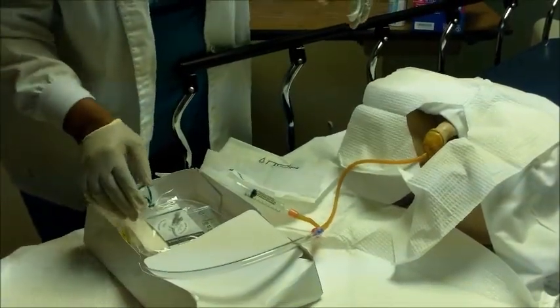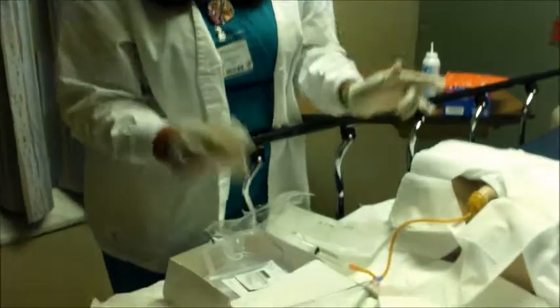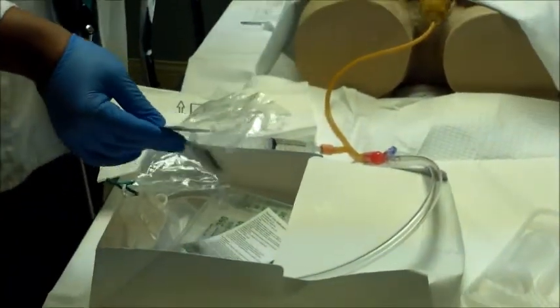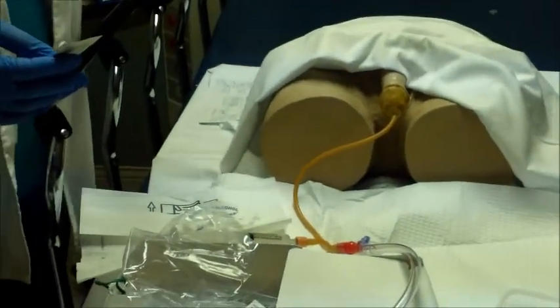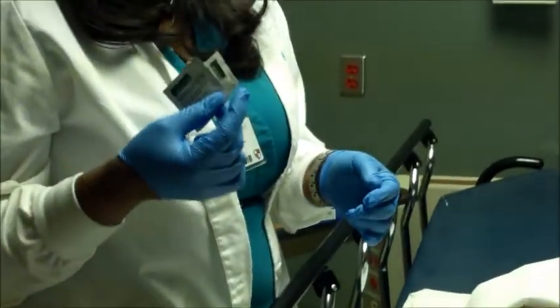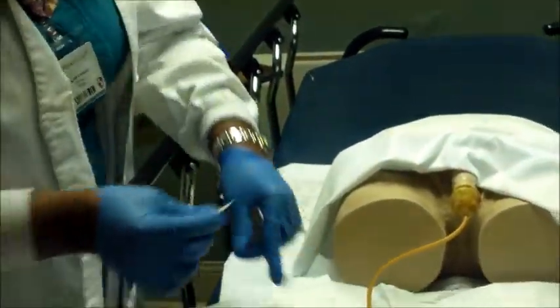Now I want to let my patient know that I have a Foley stabilizer StatLock that I want to use and put on his inner thigh. Because this is not a sterile technique, I want to advise the patient, let him know if he has a favorite side, I will put it on either side of his inner thigh. It comes with 2 skin protective pads, and I want to make sure that I wipe the inner thigh with it. Skin protective prep is dried.